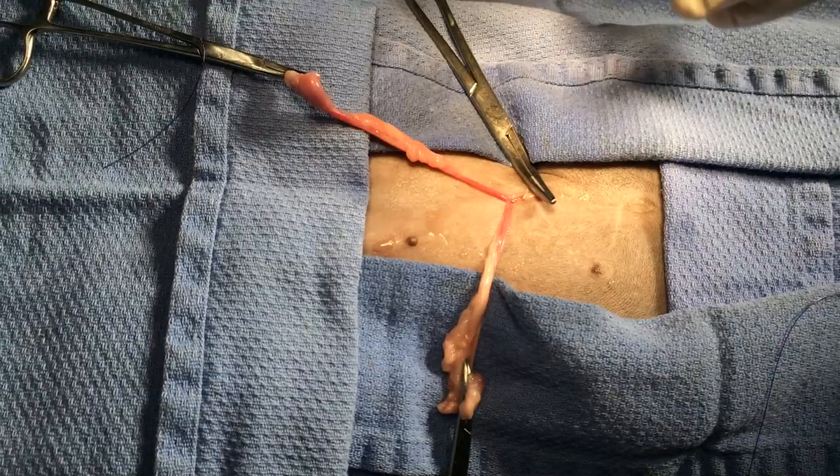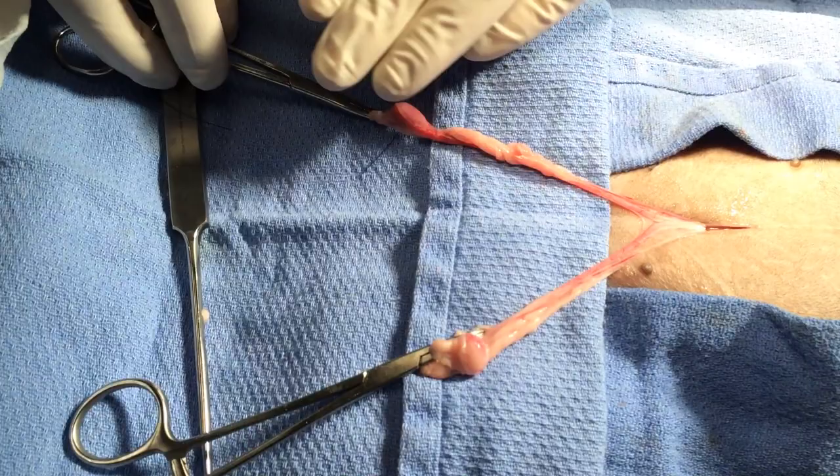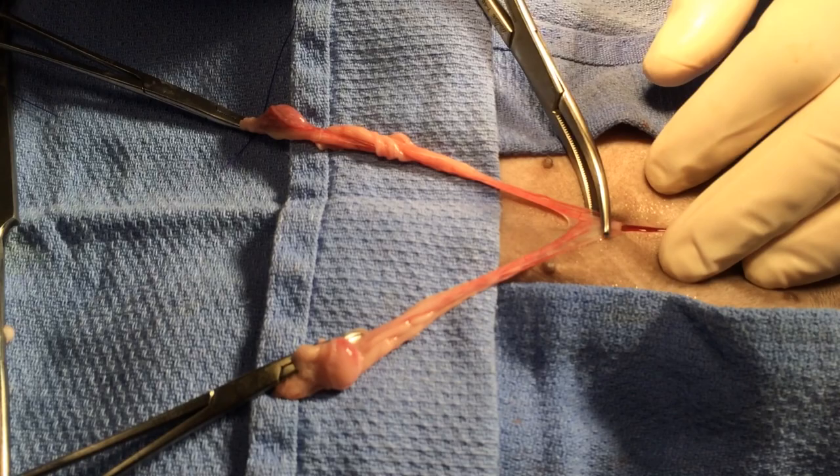Make sure that it is not attached to the abdominal. You see — it is very easy. You leave it like this, and you put the clamp from here to here, because this part is white, it is fibrosa, and that is the cervix. You don't want to disturb the cervix — you simply put it here.